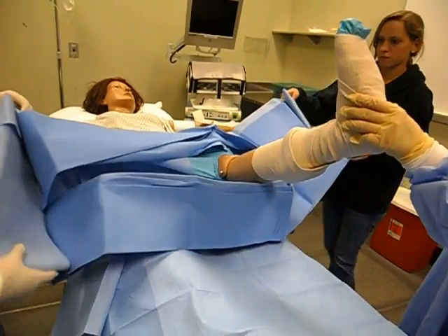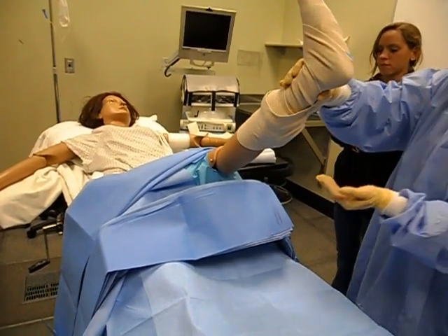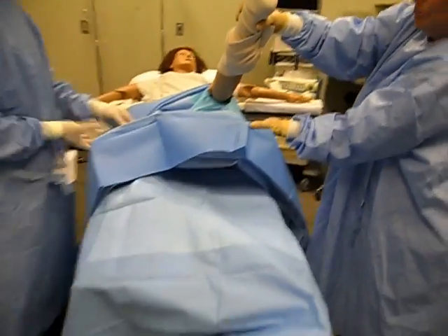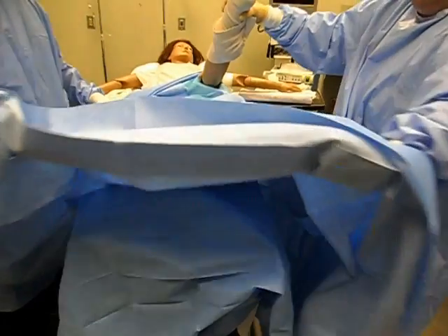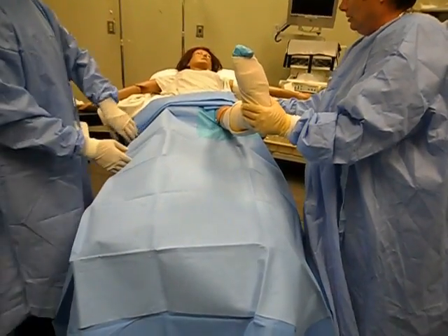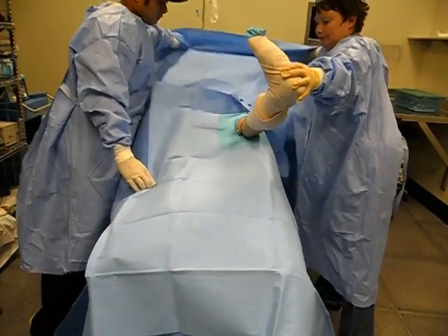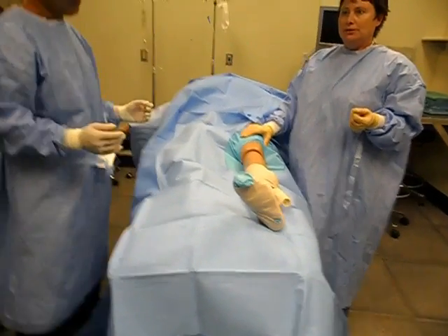Let that drop — don't drop your hands, let that drop. Now Wettner and I can grab above the bed. Protect your hand to the foot, and we're going to do the same thing on the other side. And here's our draped extremity.